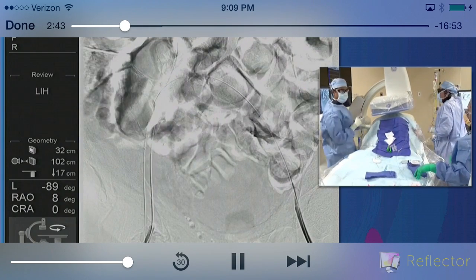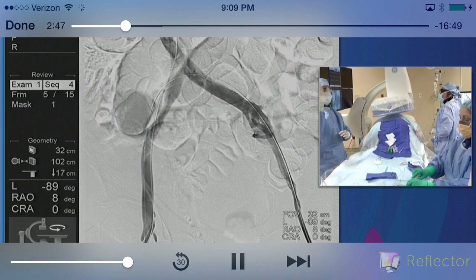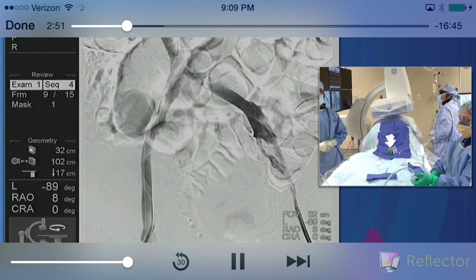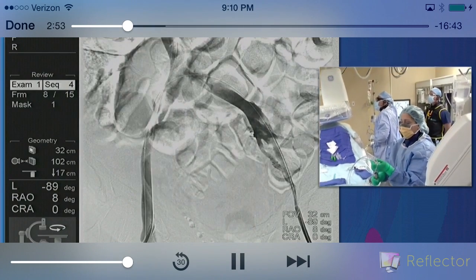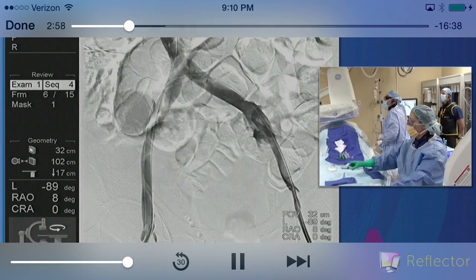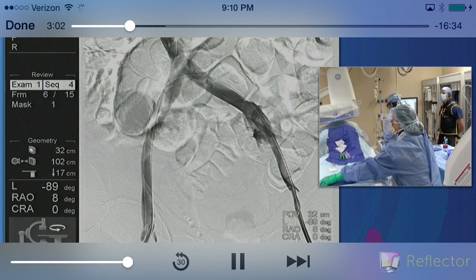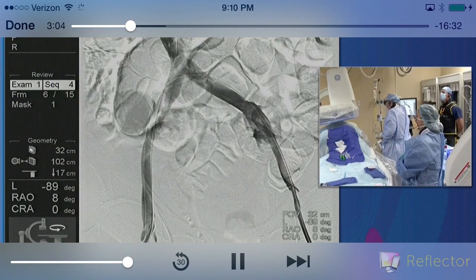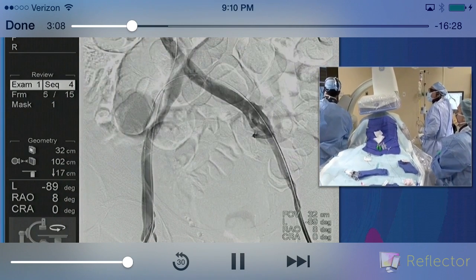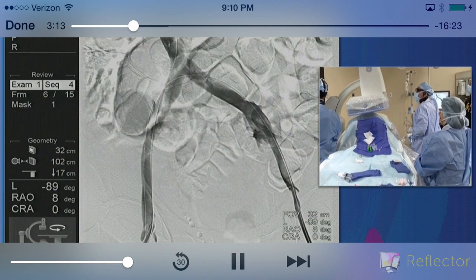Okay, so we'll run through these images here. Just notably, I'm standing in the back here. We talked about the presence of collaterals, so I have a harbinger of events here, so I think we're going to find some disease. But again, we can't even see those collaterals necessarily, which is interesting. I wonder, what do you think about that left side there? Well, it looks perfect to me. A little bit of reflux into the internal, but you're not seeing any collaterals? No collaterals seen on that.